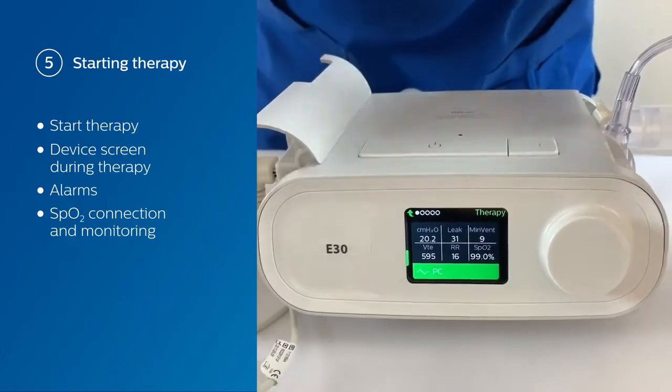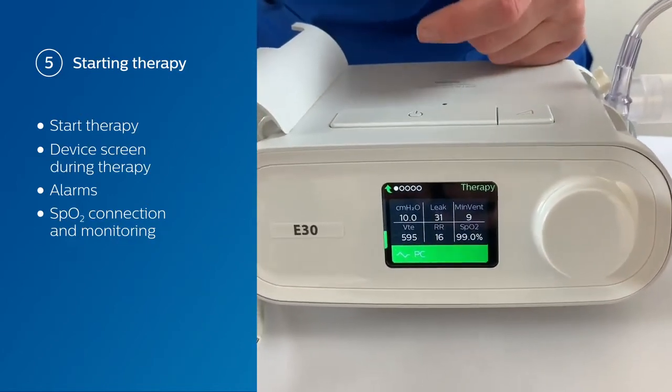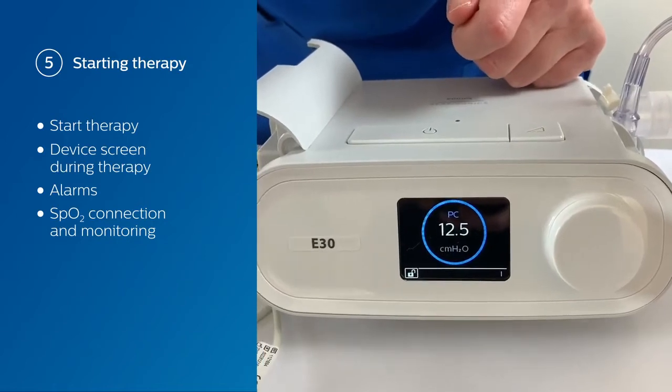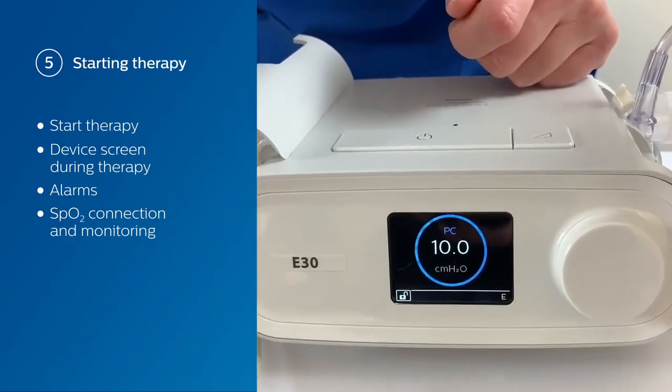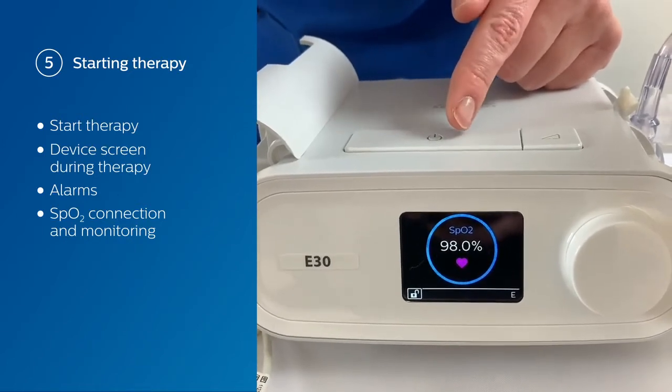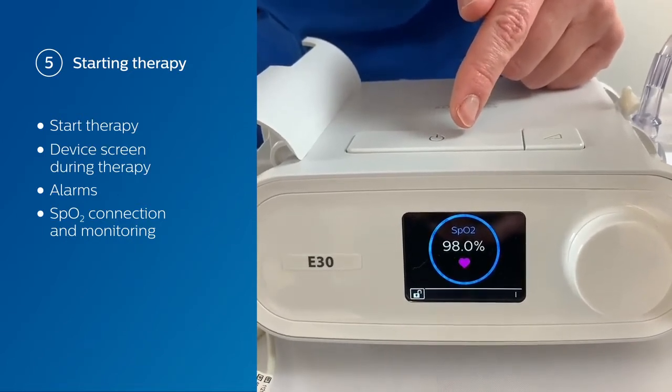Looking at the front of the device, we're going to see our SpO2. When you're on this screen, you're going to see it change between your pressures, your SpO2, and your heart rate.